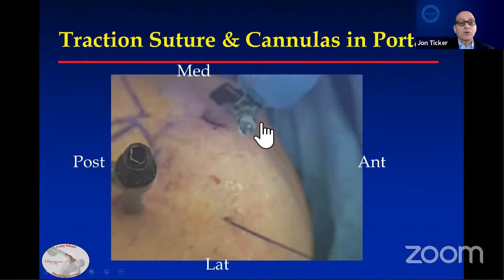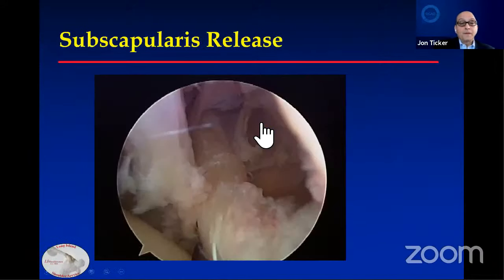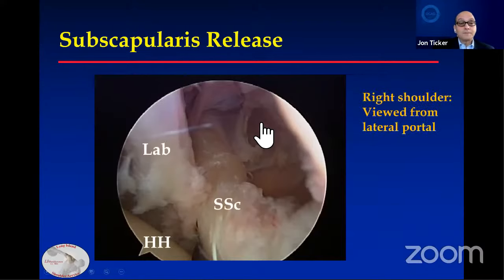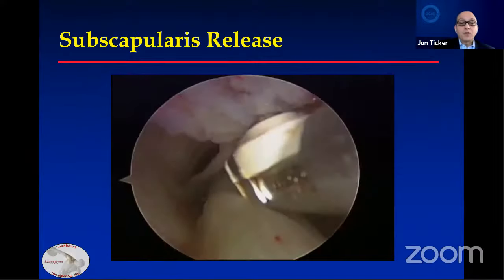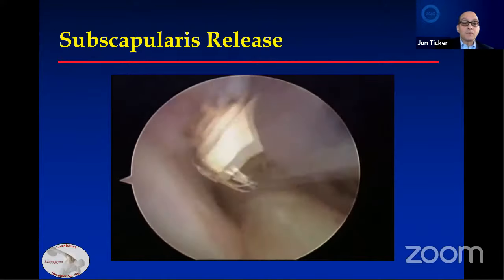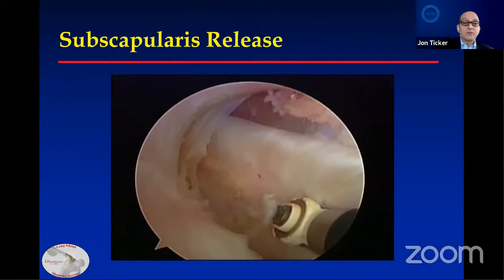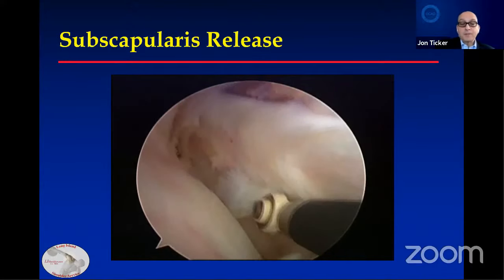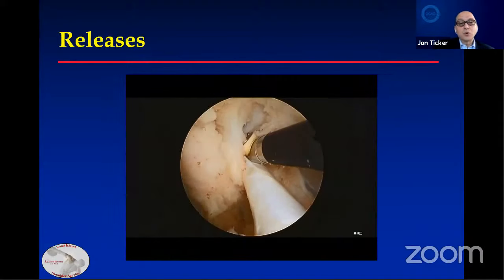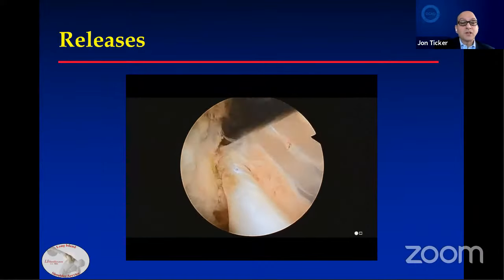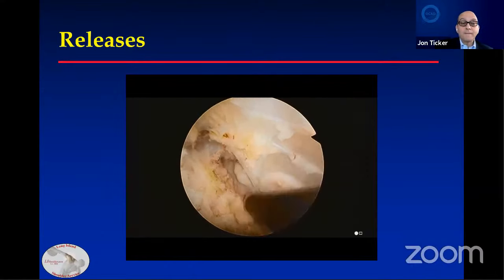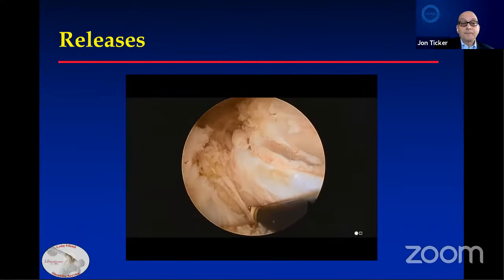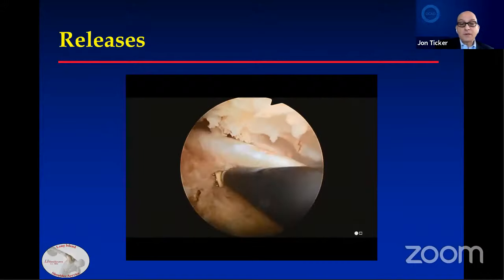Here's what it looks like exterior in this right shoulder with two cannulas. Viewing through the lateral portal: the anterior labrum, humeral head, and subscapularis are identified. Then you want to release the tissue to the base of the coracoid — this helps control bleeding as well as remove soft tissue. At the top of the view is the coracoid, which I'm underneath. In this case it was fairly straightforward to release the subscapularis, though sometimes there's more scar tissue to release. The goal is to make sure it's free and mobile, then release around it so it is in a good position to be repaired.